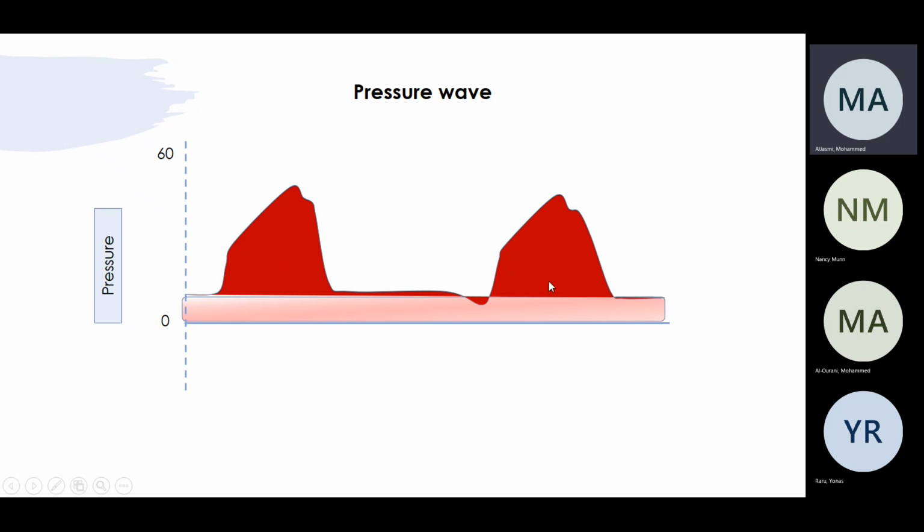And it's very important for a physician to know if the patient is triggering the machine or not. Okay. So if the patient is triggered here, the machine will give him, or does that depend on his effort? That's a good question. So it depends on the mode that you are using. Let's say you are in VC-CMV, your patient is in volume control, and there is a set volume that the patient will take. Is that right? So when you take the breath, the machine will assist your breath to give you the exact volume. However, if you need more, that's when you start seeing dysynchrony.